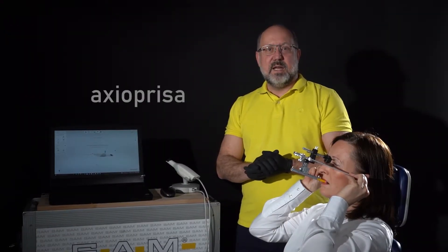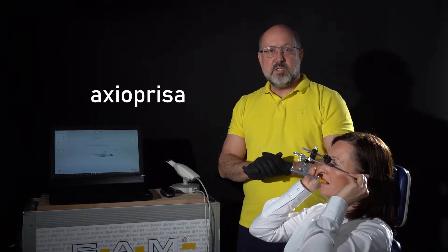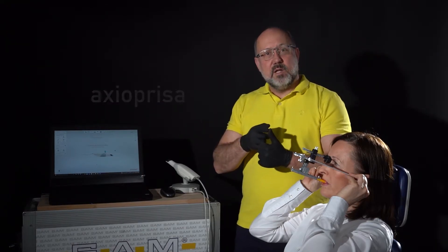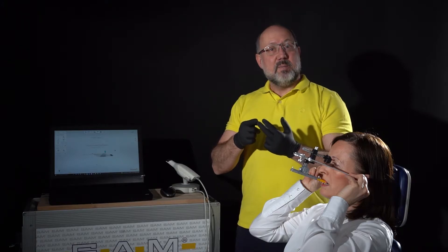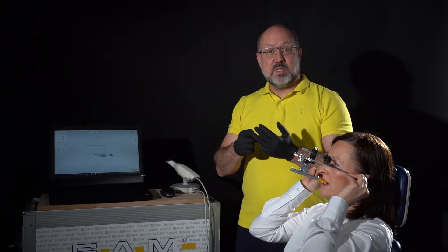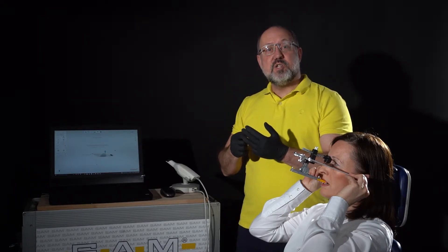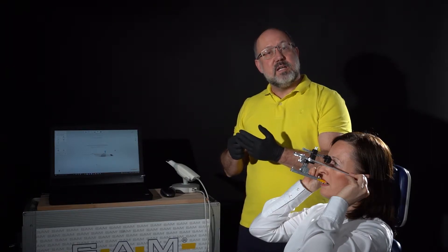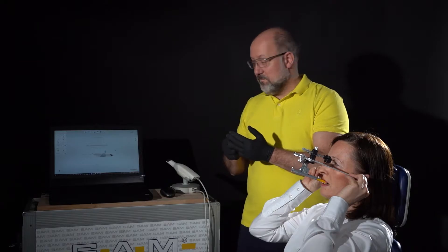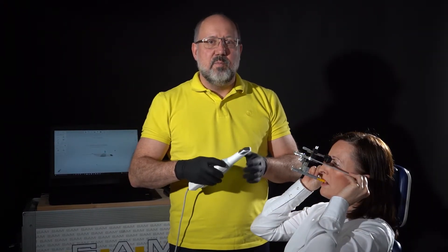Let's start with the scanning. We're using the three-shape trios. I made my lower scan, made my upper scan, made my bite scan, and now I'm making a second upper scan. Therefore, I have to switch off and deactivate the artificial intelligence because this is our position scan. So let's start to scan my position scan.